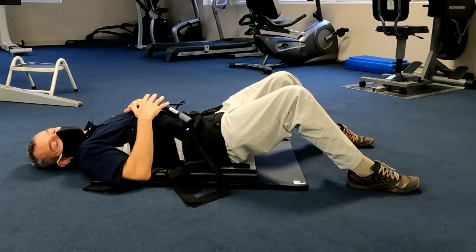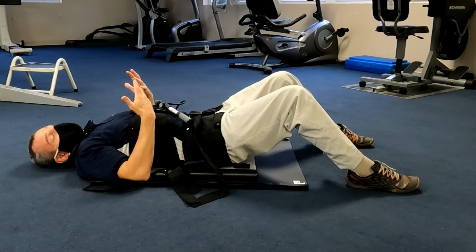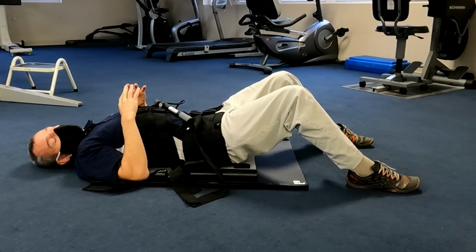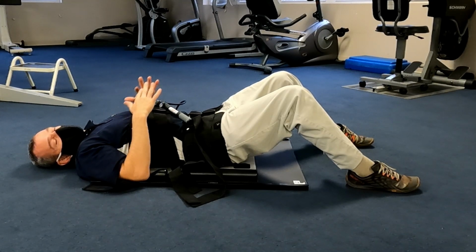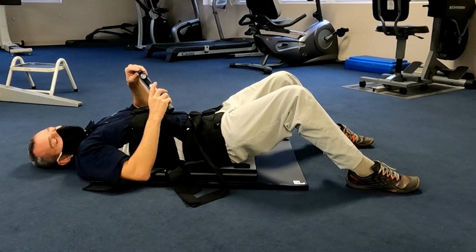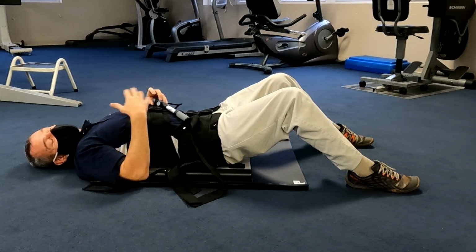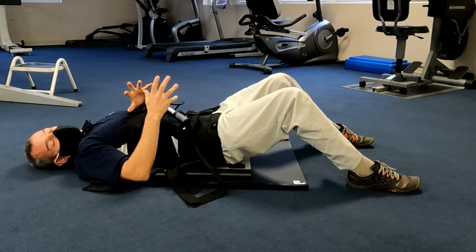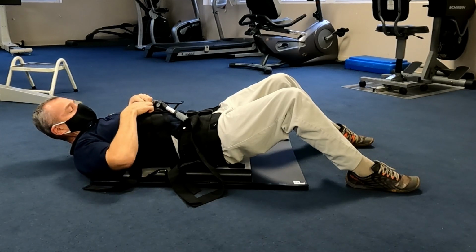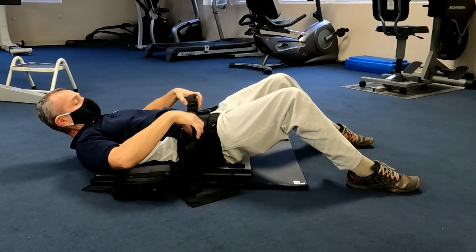It's relaxing. There's not much going on. I could have a pillow. I could, whatever, listen to music. And for 15 to 20 minutes, I would just relax in this position. When I'm done, I press the button. It releases the tension. I would continue to lay here another minute or two. And then I would go ahead and just release and come on out.